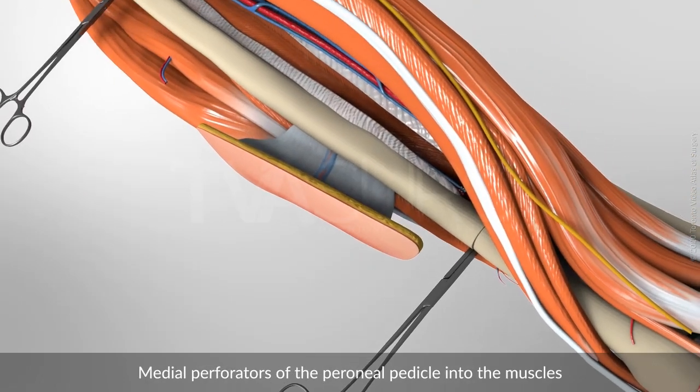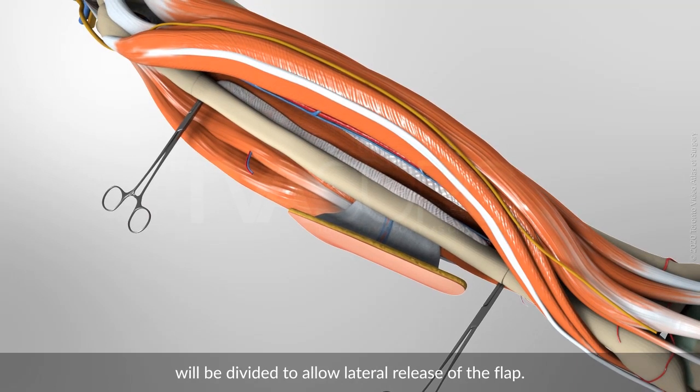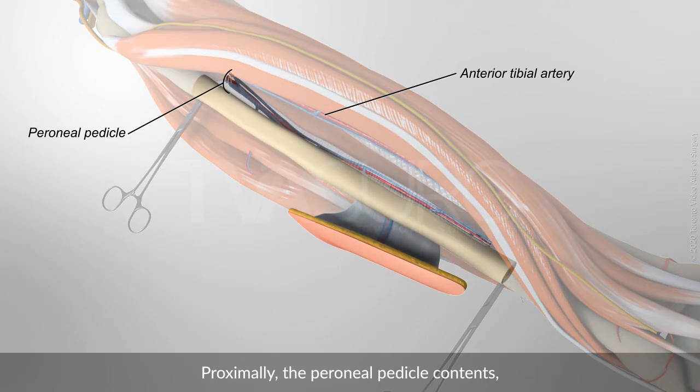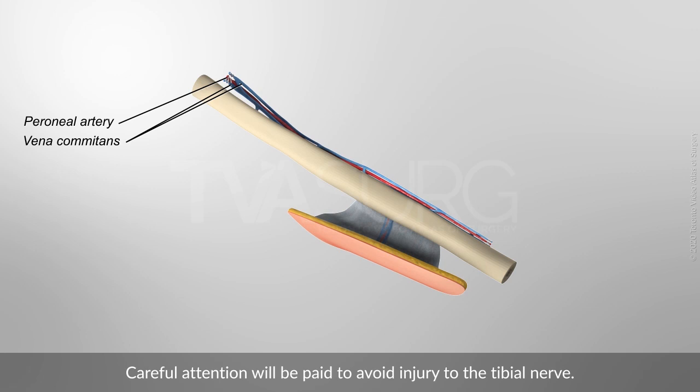Medial perforators of the peroneal pedicle into the muscles will be divided to allow lateral release of the flap. Proximally, the peroneal pedicle contents, including the peroneal artery and vena comitans, will be divided. Careful attention will be paid to avoid injury to the tibial nerve.